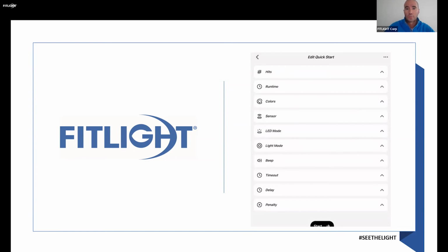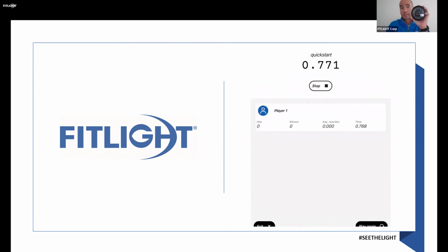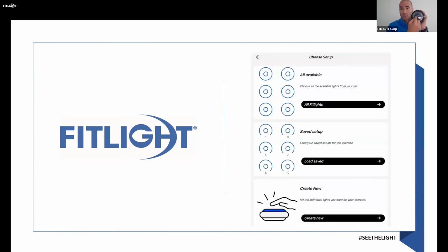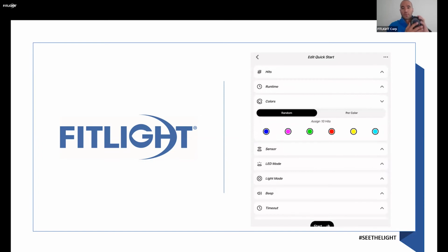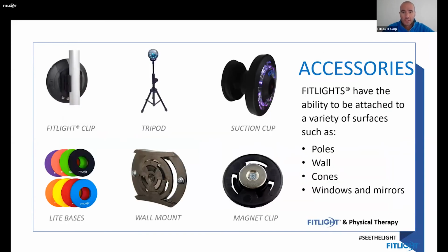Do you want both LED rings on, because each light has 2 rings of LEDs, the outer ring and the center, so you can program it that way that it will be a full light, meaning both rings will go on, just the center or just the outer ring. Especially, for example, you train your peripheral vision if you have lights spread out on the wall in front of you. If you just have the center on, it will be more difficult to see, so you have to focus harder.